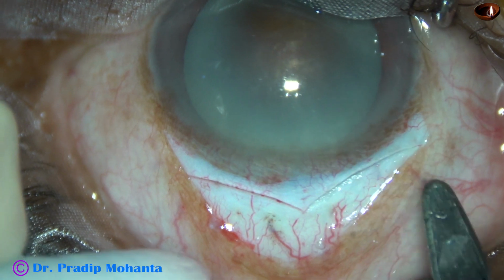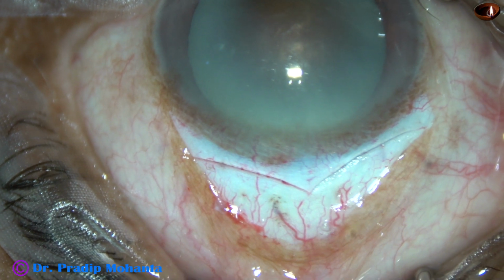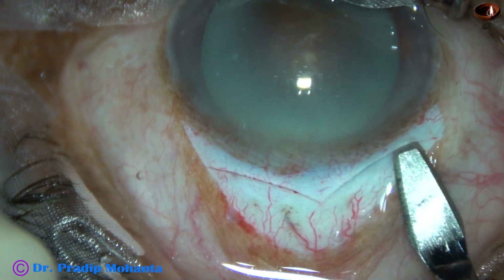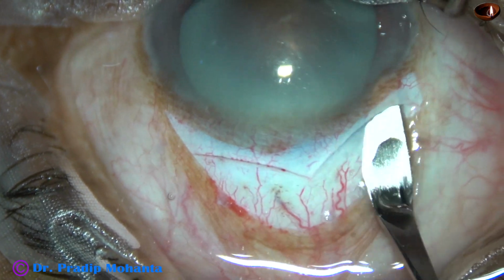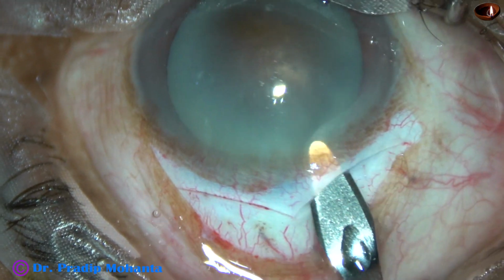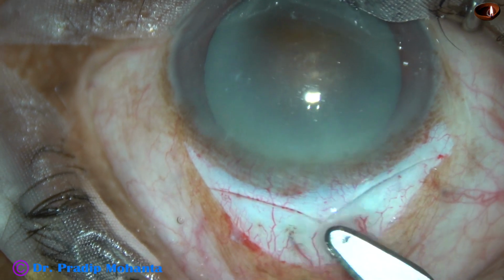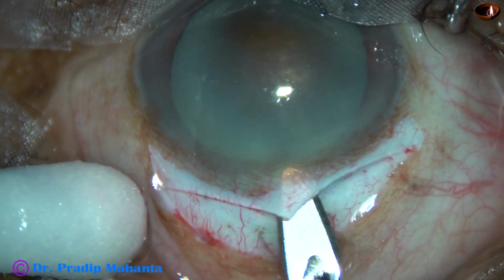And now, just like small incision cataract surgery, a sclerocorneal tunnel is going to be made, and I have started making the tunnel. Go to a depth of almost half thickness of the sclera, and here it is. Started the tunnel from the right corner, come to the center, and here I go and raise the apex, that is the joining point of the two SICS wounds.